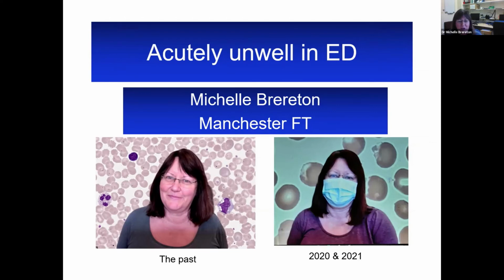So this gentleman has come in through A&E, and our favourite diagnosis from the emergency department is "unwell". To get "acutely unwell" might be considered a bonus, but it might also add an air of urgency here. The full blood count had a mildly raised white cell count and a raised RDW, red cell distribution width. So a blood film was done. At that point, the hemoglobin was virtually normal, and there was nothing unusual about the rest of the indices.